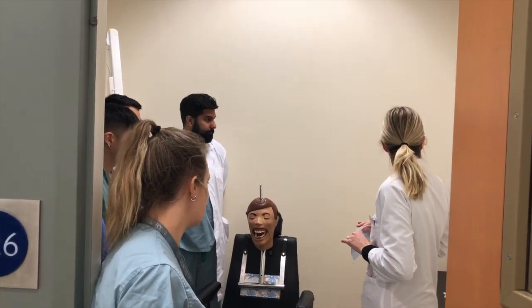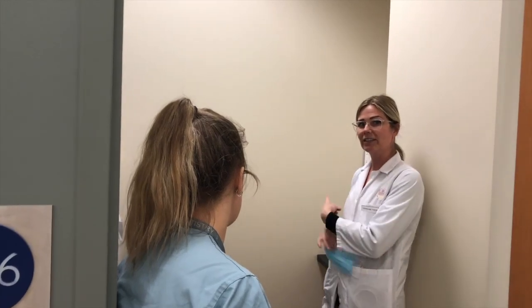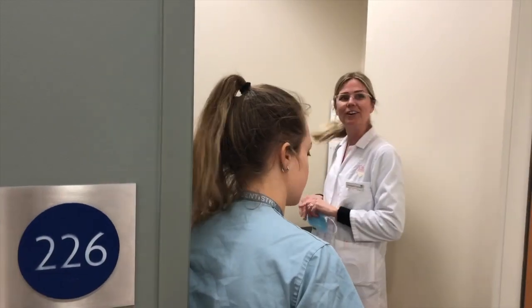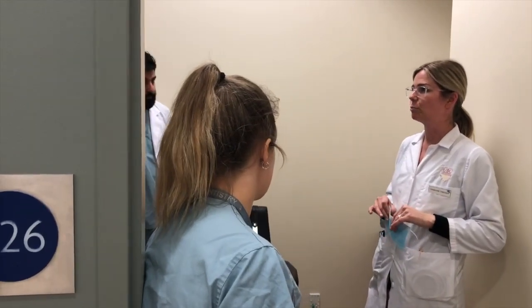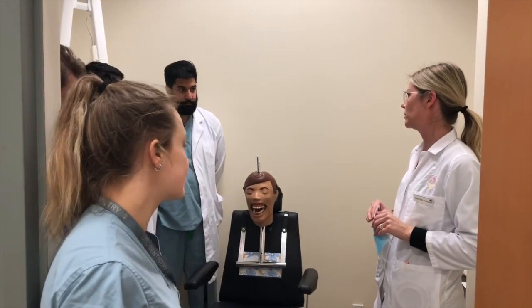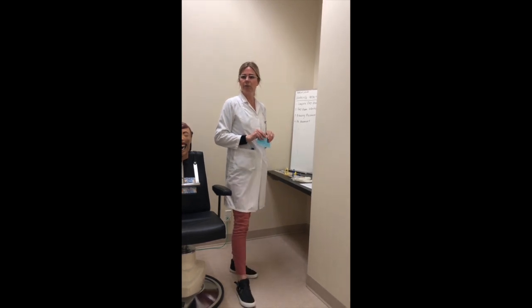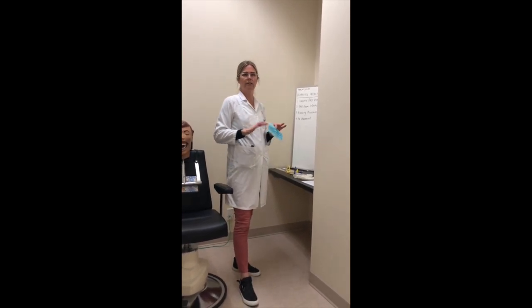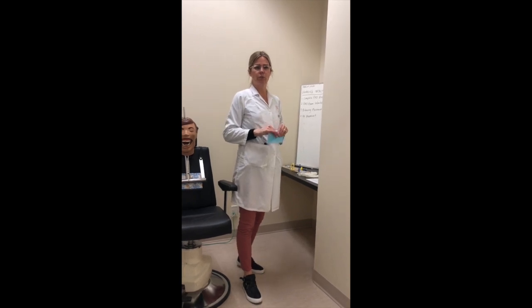We are going to go through bite wing placement and PA placement. The objectives are written out on the whiteboard. After that you'll get a chance to practice on the Dexter and then we'll go through some questions if you have any. So first of all I'm going to go through the entire infection control procedure in the radiology room.